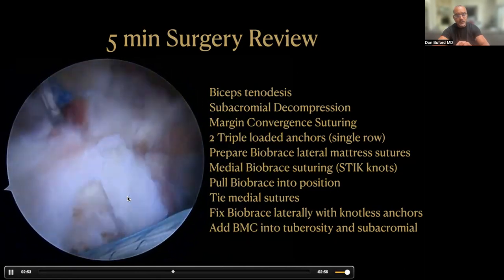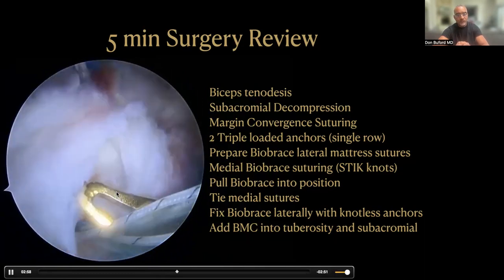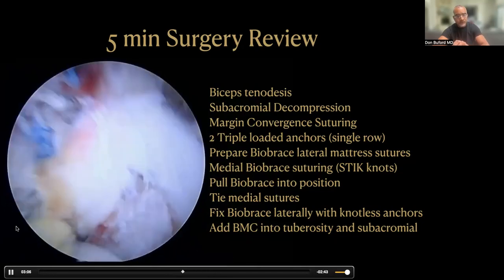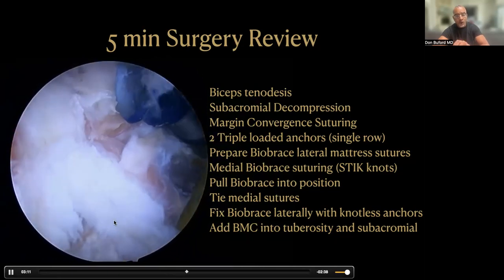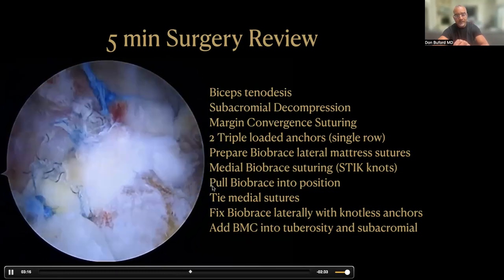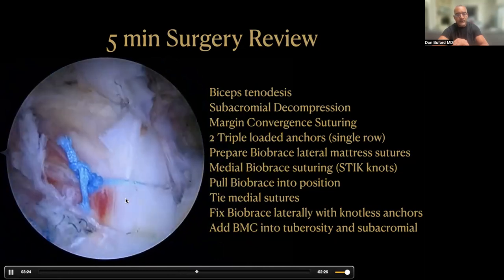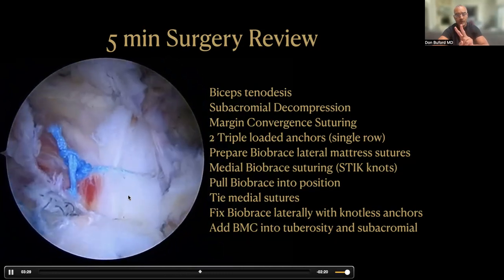We've almost got that tendon completely covering the humeral head just from four side-to-side sutures, but we're far from done. We still need anchors and sutures to hold the tendon down to the bone — it has to heel to the bone as well. Our most posterior triple-loaded suture anchor is placed; this is a single-row technique for me, and all three sutures are passed and tied through the infraspinatus. We then place a second anterior triple-loaded all-suture anchor. Once those are tied, we now have six sutures holding the tendon down to the bone, with the humeral head completely covered — four side-to-sides and two triple-loaded anchors.